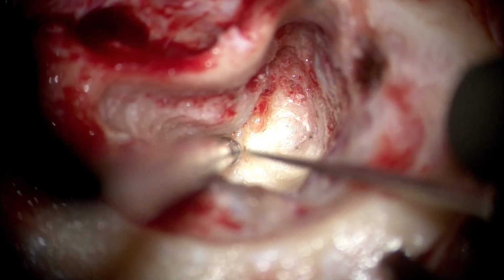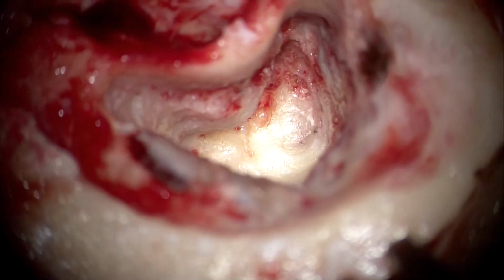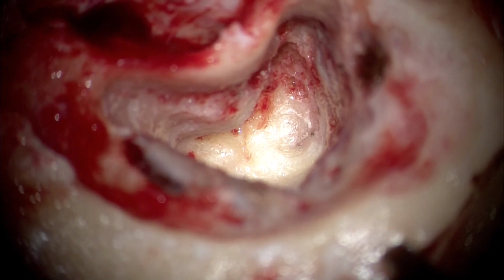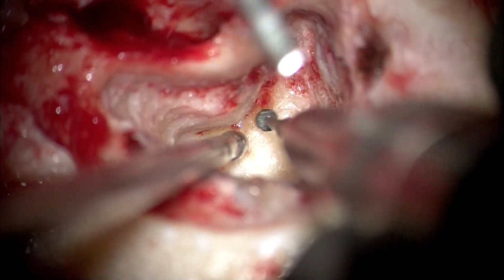So we could use a cotton ball as well, or use the same right angle pick to scrape out all the neuroepithelium. And once done, that finishes our labyrinthectomy procedure.